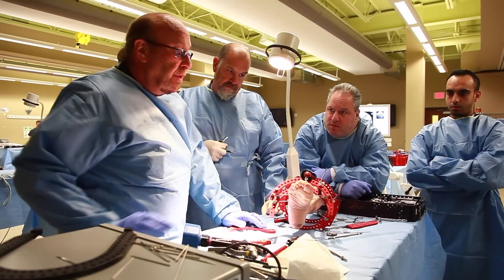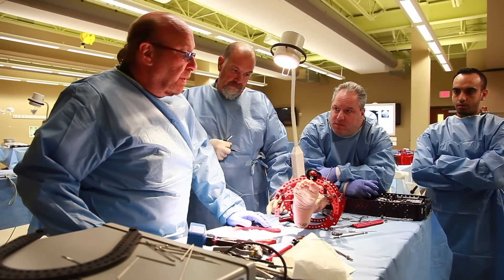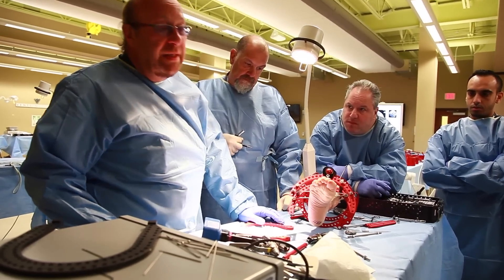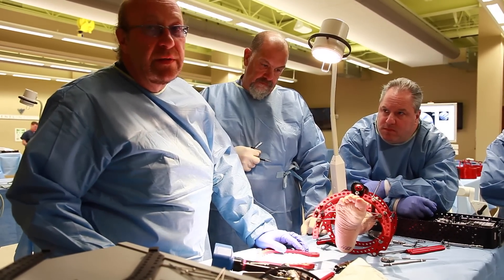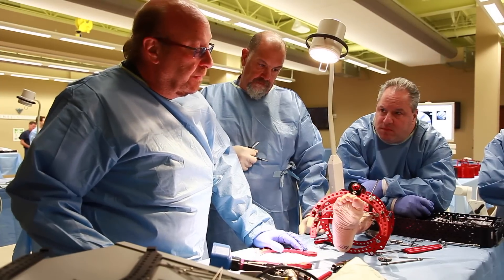Since the advent of compression and adjustable struts, particularly ones like this, we've found that it's easier and much more effective to treat calcaneal fractures with external fixation than it is with open reduction internal fixation.